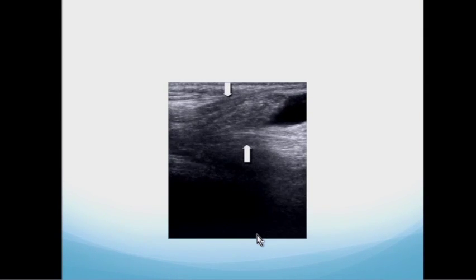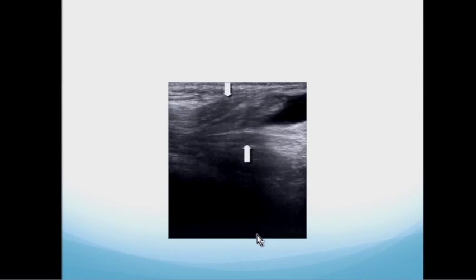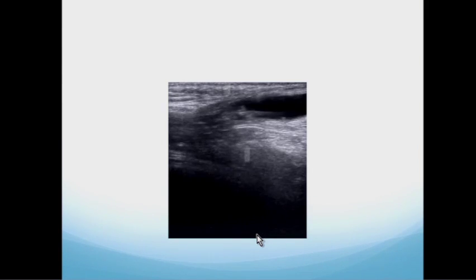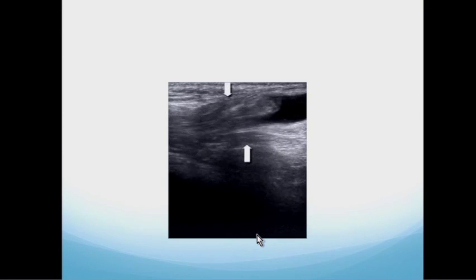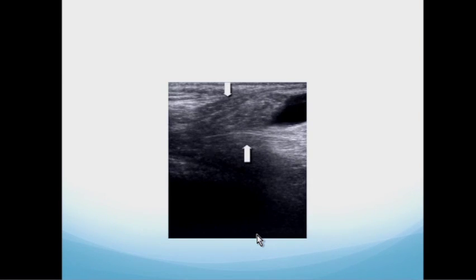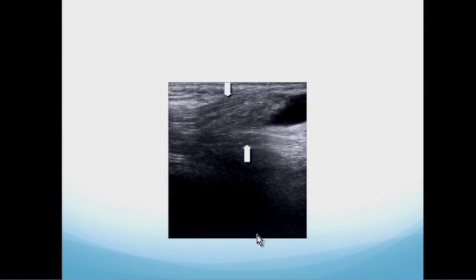This is an example of an indirect hernia sliding down the inguinal canal. There's a lot of fluid associated with it. When the patient relaxes, the fat of the hernia pops back up and almost out of the canal, but doesn't quite reduce completely.